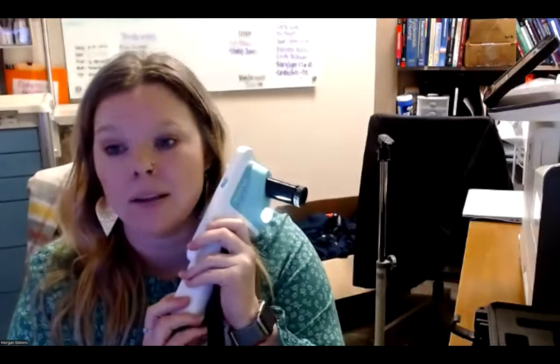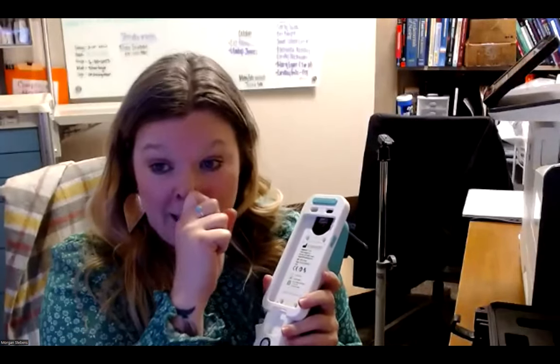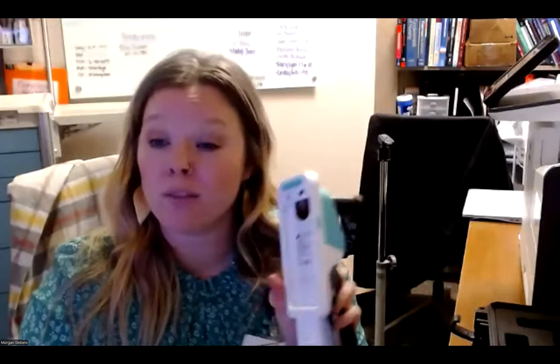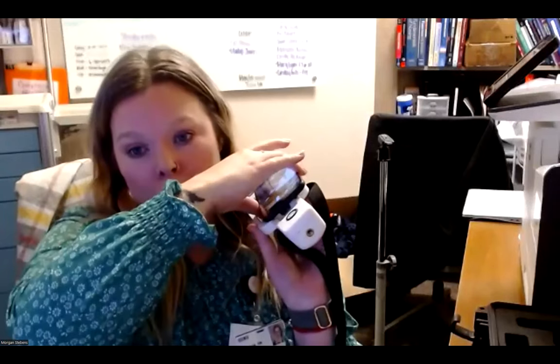And then there is a light on the colposcope that you can utilize. This power button is for nothing but the light on the front. This is excellent whenever you are doing a speculum exam and you need a little extra light, you can just pull this right over. It also has your charging port here, and if you leave your device inside the colposcope, you can charge it that way. When it slides in, you can charge it underneath.